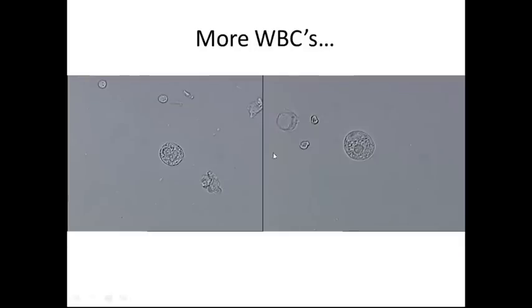So here are some more examples of white blood cells. Granulation, and here are some with the nucleus that you can see. Note the size of the white blood cell and how big it is. White blood cells are many, many times bigger than your red blood cells. So this white blood cell is huge, and then here you have a red blood cell. Note the difference in size between the two. Also, note the concaveness of the red blood cell. White blood cells do not have that.